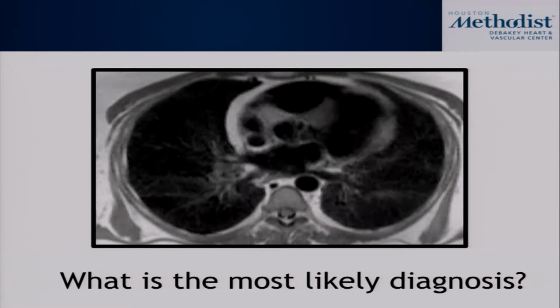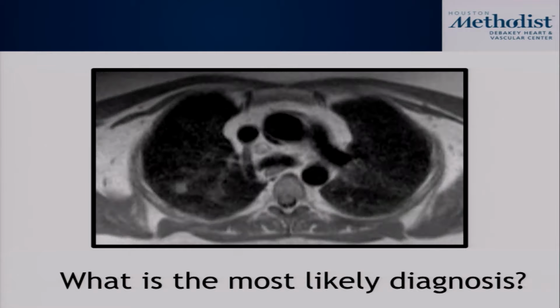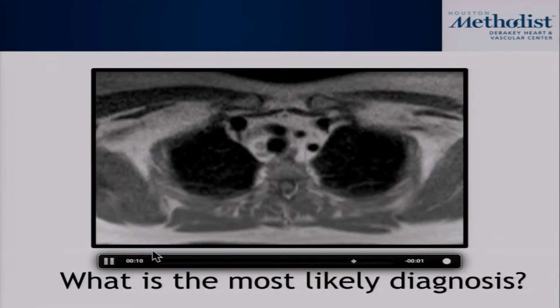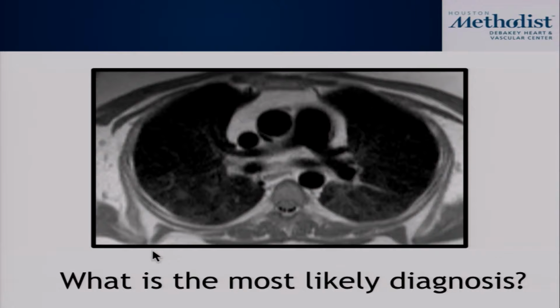And then lastly, in every study that we do, we always want to take a look at the entire chest. And what do you notice? Maybe any of the fellows that are doing CT imaging. What do you notice on these images here? Anything that strikes out at you? What was that?